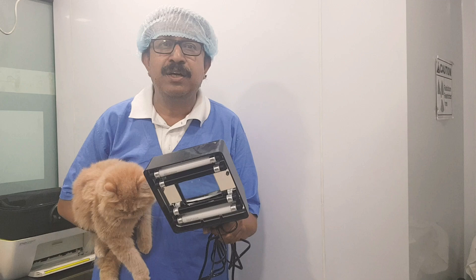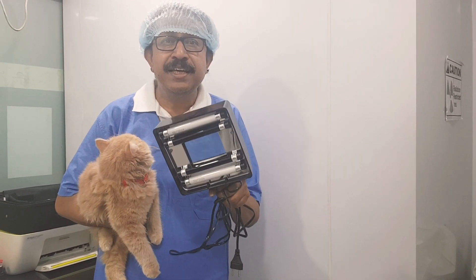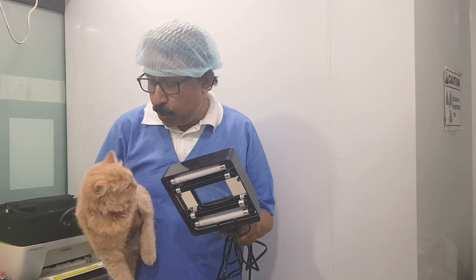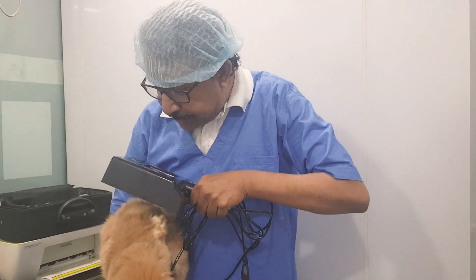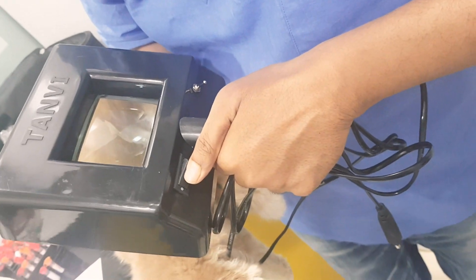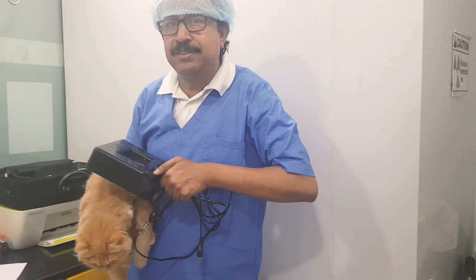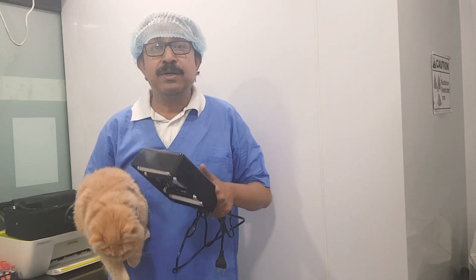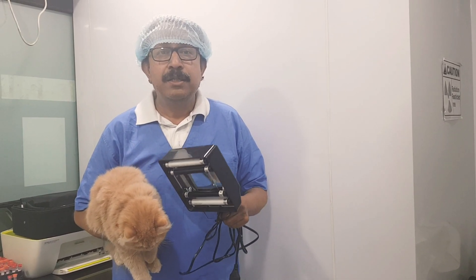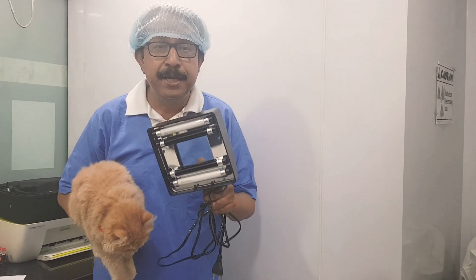Dermatophytes produce a fluorescing metabolite — they glow on the hairs when examined under the Woods lamp. This lamp has two lights: normal and ultraviolet. The dermatophytes glow on the hairs, and understanding how and why they glow is very important.